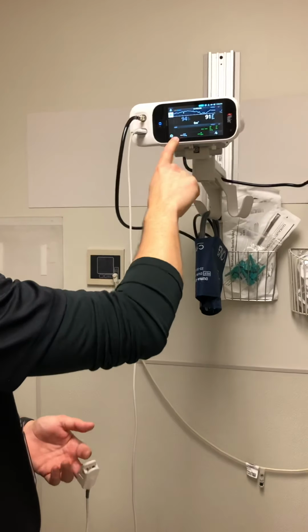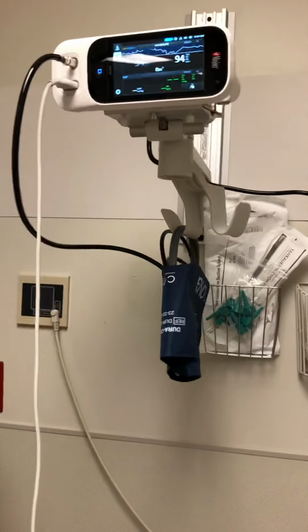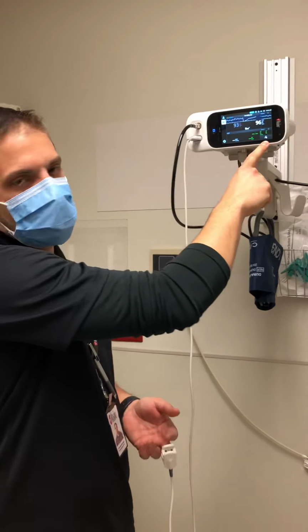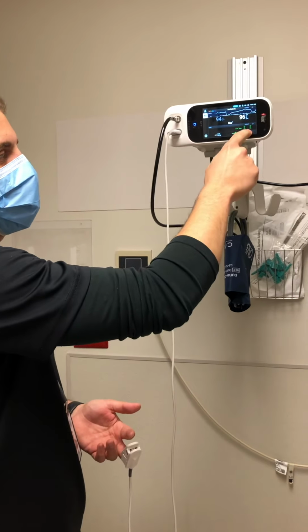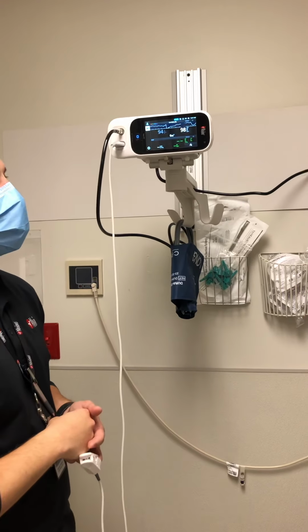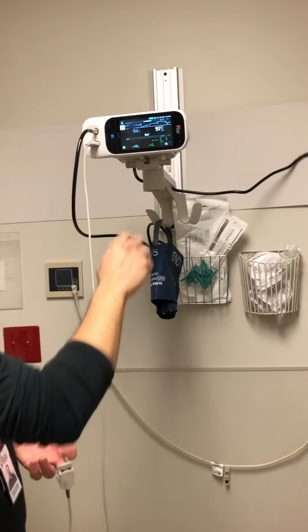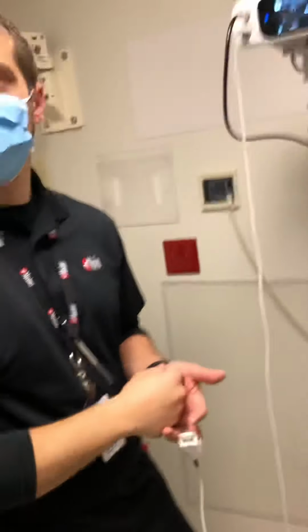So at the bottom is your blood pressure. Blood pressure plugs in on the left-hand side of the device. You guys were already using this. But international sign to cycle a BP is just a man with a cuff on the arm. It will highlight blue, showing you that it's running an active BP, but because I don't have myself hooked up, I'm just gonna cancel that out, okay? After the cycle runs, you'll get your blood pressure reading here, your MAP, and your pulse rate associated with the BP as well. This creates an issue. Okay.